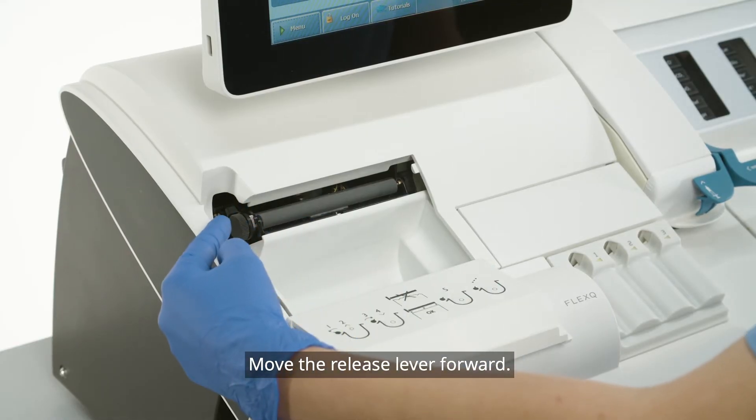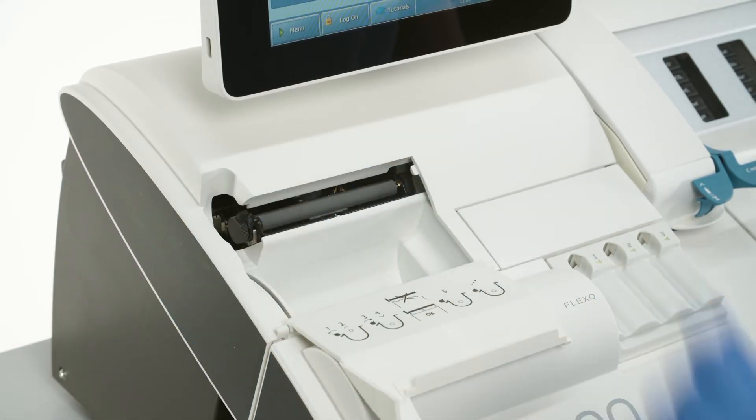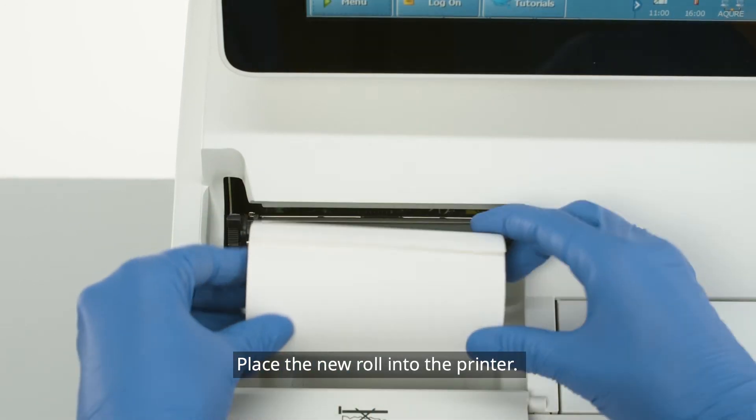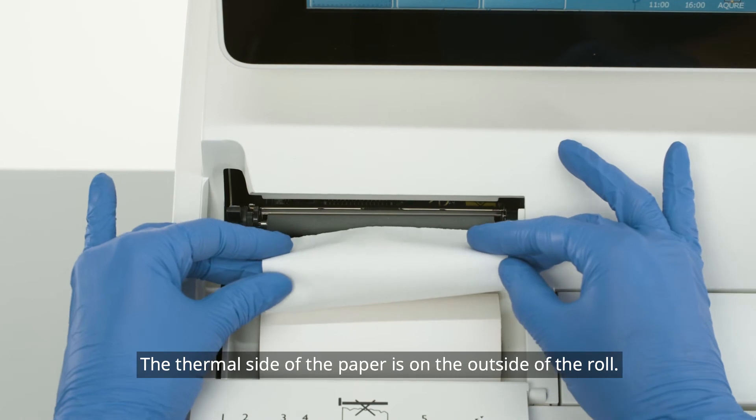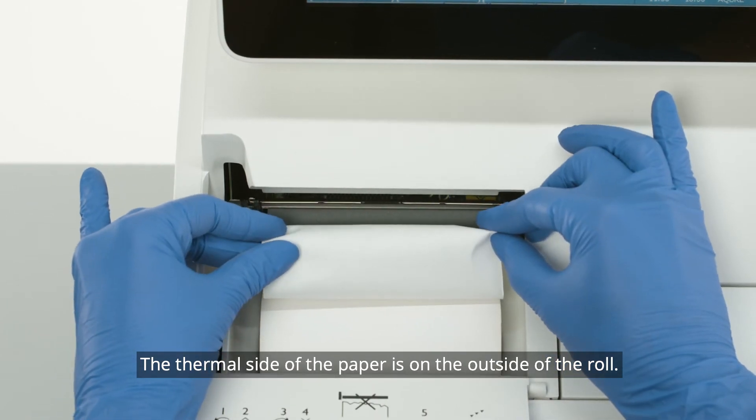Move the release lever forward. Place the new roll into the printer. The paper unreels from underneath the roll. The thermal side of the paper is on the outside of the roll.